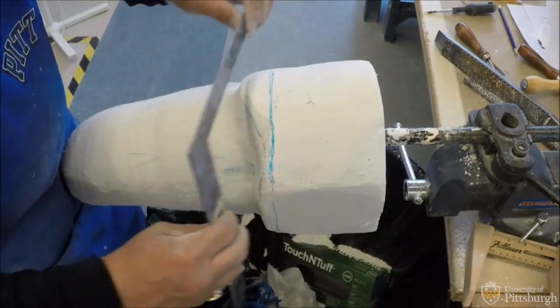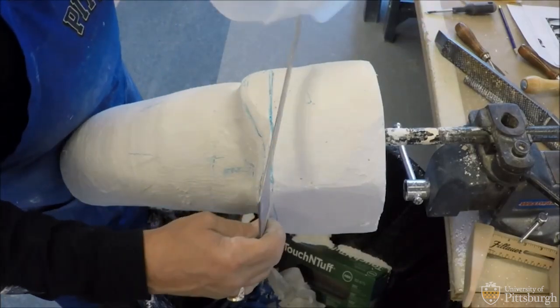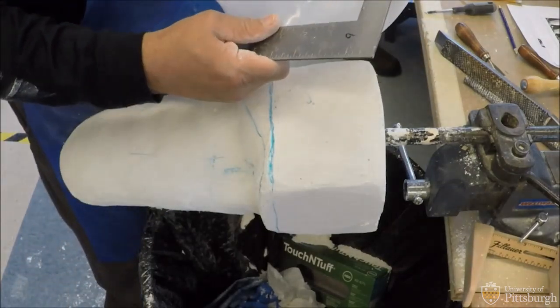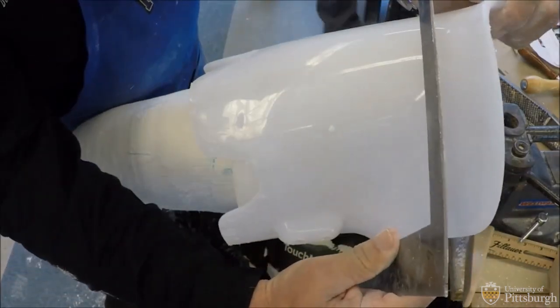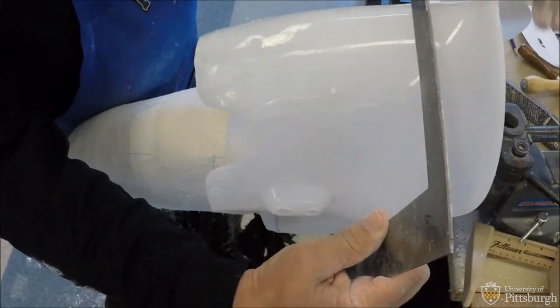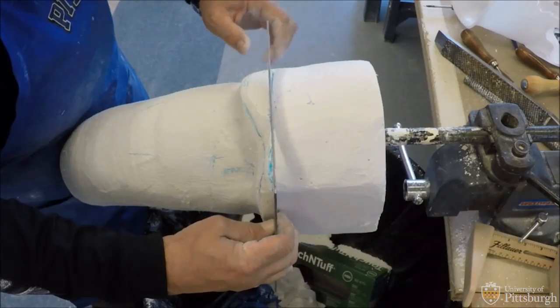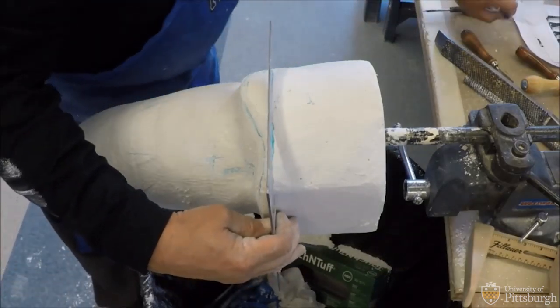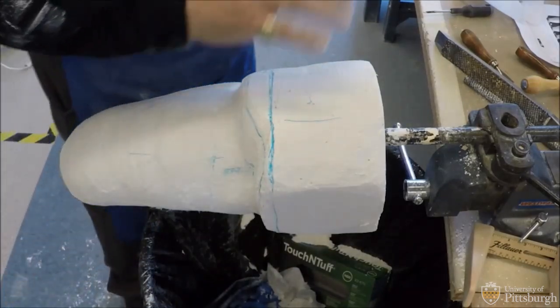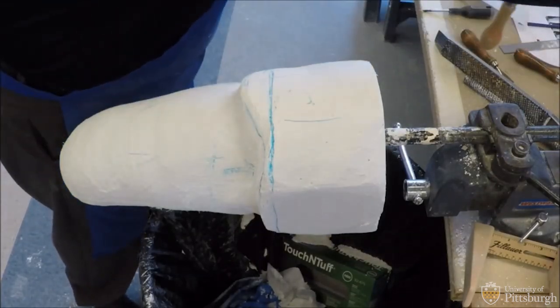I'm moving on to my posterior shelf. If I look at my brim, it's not actually square, but if I lay my square on it, you can see that at this particular point I have an area that's broad. Mine is a little rounded, so if I lay my square on my medial wall, what I want to do is create more of a flattening back here so he's not sitting on a roll. I'll take my draw knife and I'm just going to create a slight flattening in that area.